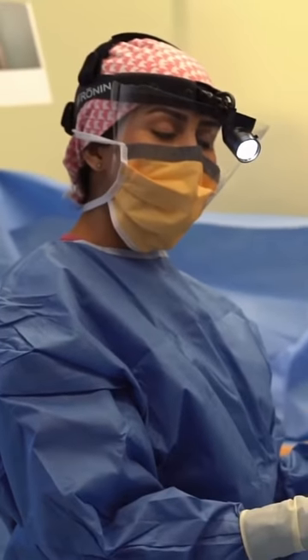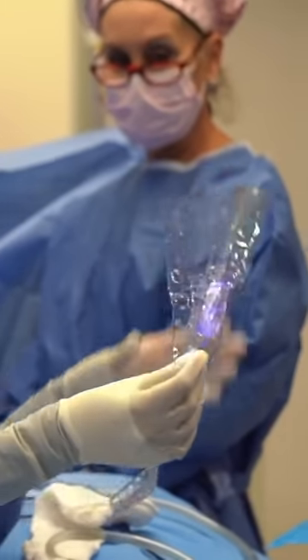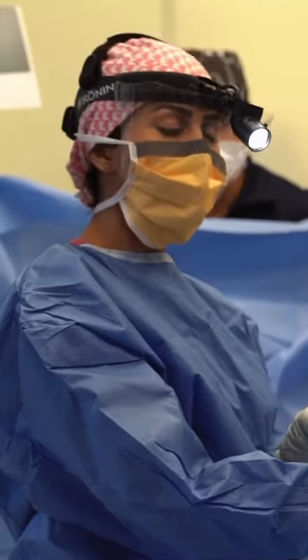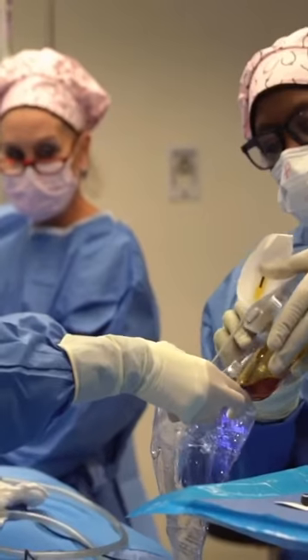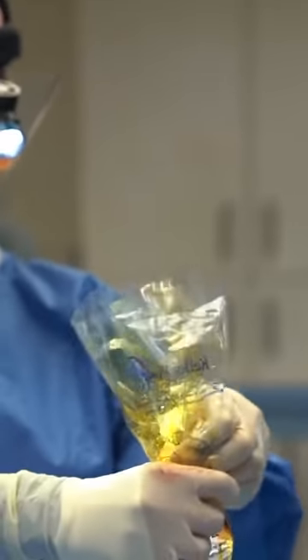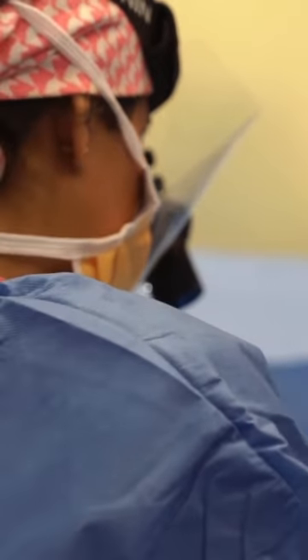The way we put the implant in is also extremely important. We use a Keller funnel, which is really special because nobody touches the implant. The implant goes into the funnel so it doesn't come into contact with the skin either, and it goes in really easily — allowing us to use that really small incision I showed you earlier. As you can see, I'm not touching the implant; I'm clearly using the funnel to slowly and carefully place that implant inside the body.